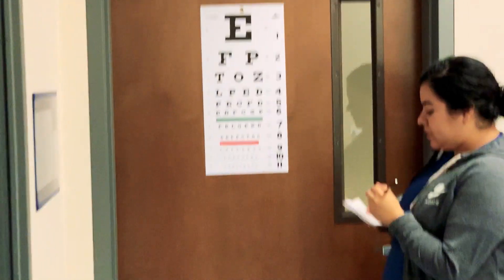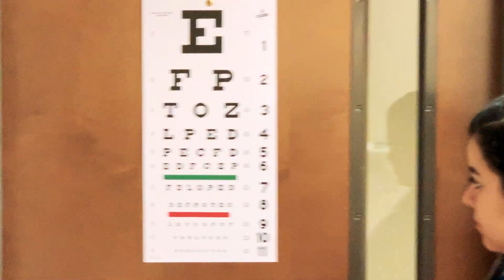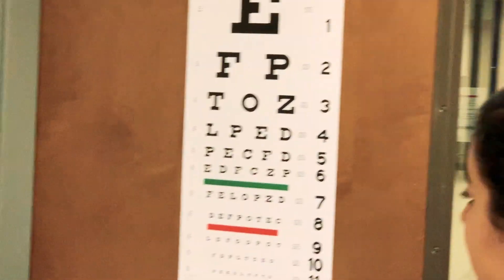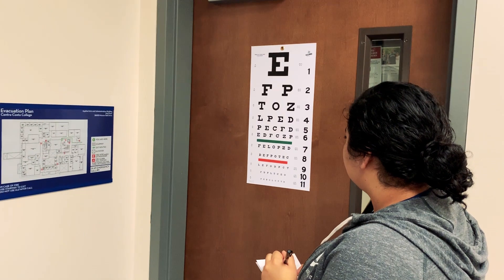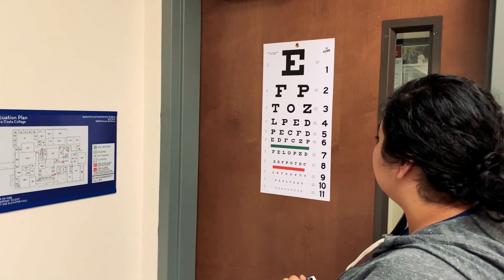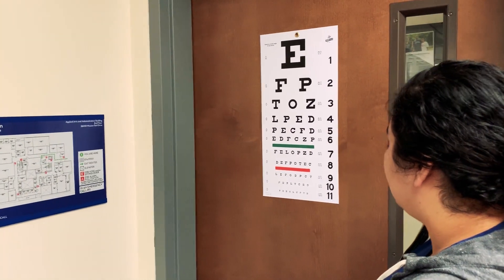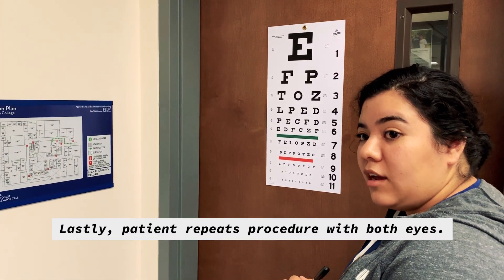Can you read row 6 again, please? Okay. It is E-D-F-C-Z-P. Okay, and you can go ahead and uncover.